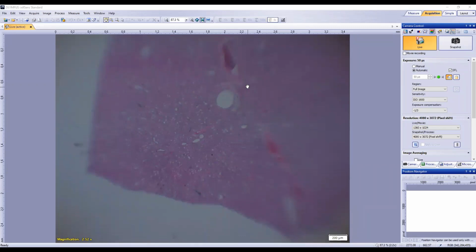Yeah, that's a good thought process. Now we'll have to be a little bit cautious and go examining for that specifically as we get closer, because of course arteries, veins, and lymphatics have different thickness and different resilience of the walls. So some are more or less likely to collapse depending on what's going on.